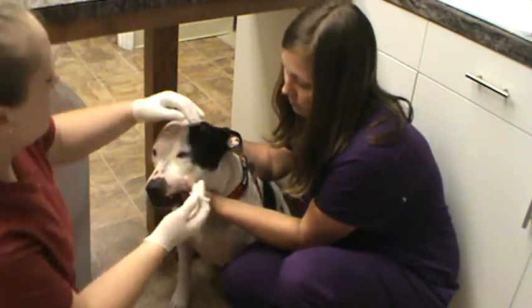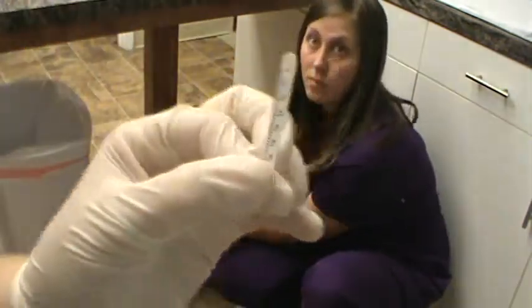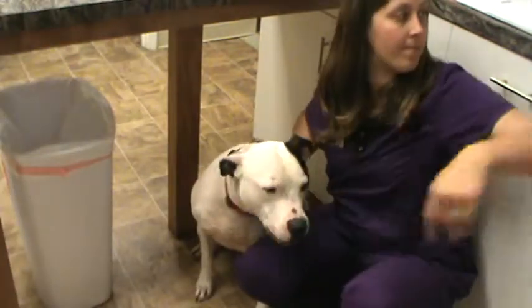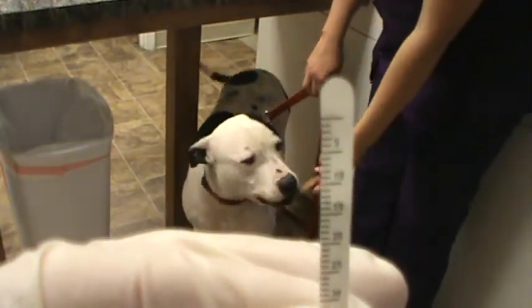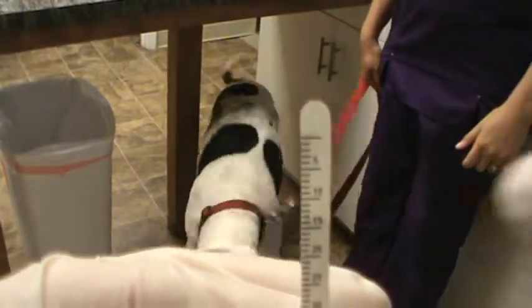We're going to take that out and take our measure. I'm going to come up real close here. Looks like we're at about 14 — I'm not sure you can see it on the actual strip — but about 14 is where that white part becomes that grayish part. So about 14.